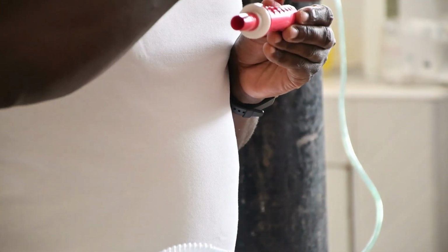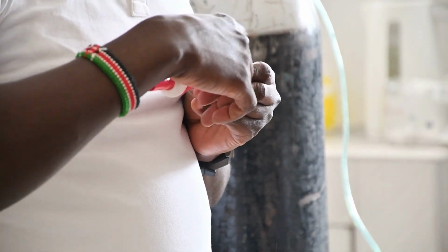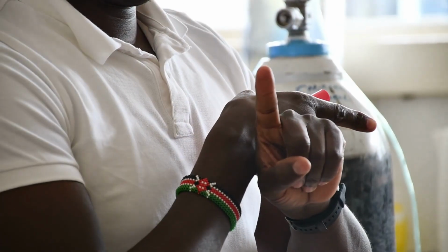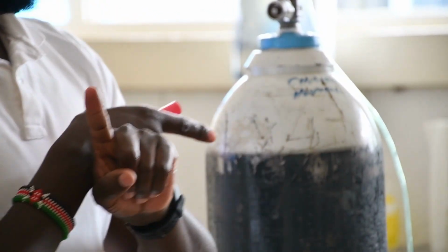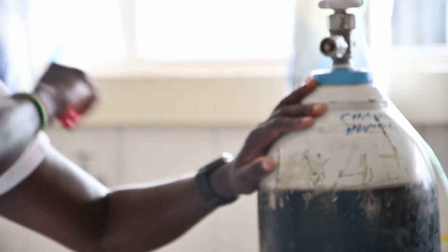When I'm at 100%, go back and look at the nozzles here. What has happened to the nozzles? They close up. What that means is that whatever is coming from this source is all going directly out. So you're providing 100%, and there is no blending happening.